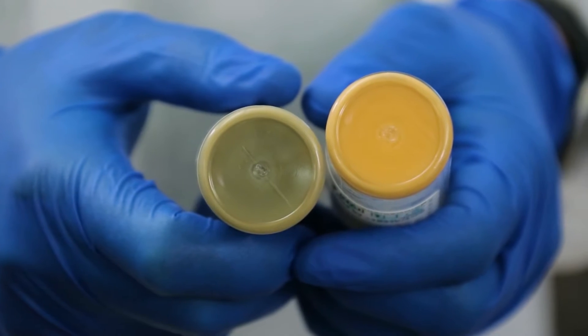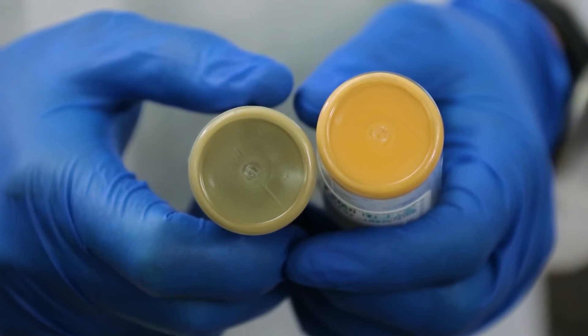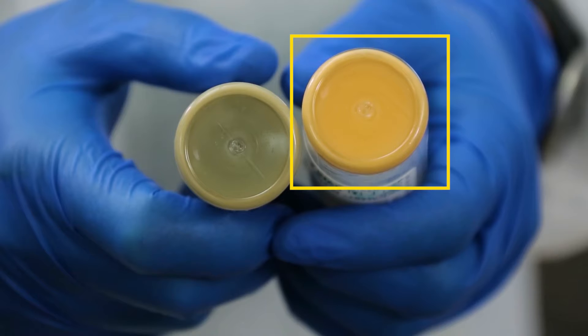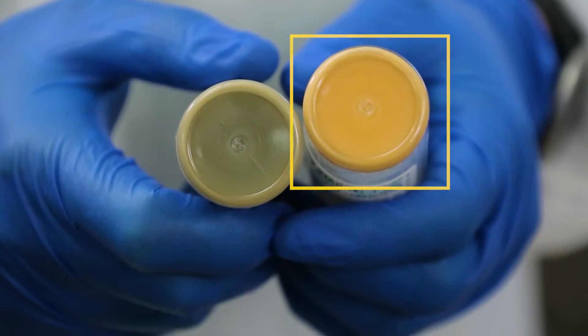Signs of positivity: prior to loading the bottles, check the sensor on the bottom of the bottle. If the sensor is already yellow, indicating growth, gram stain and subculture the bottle.